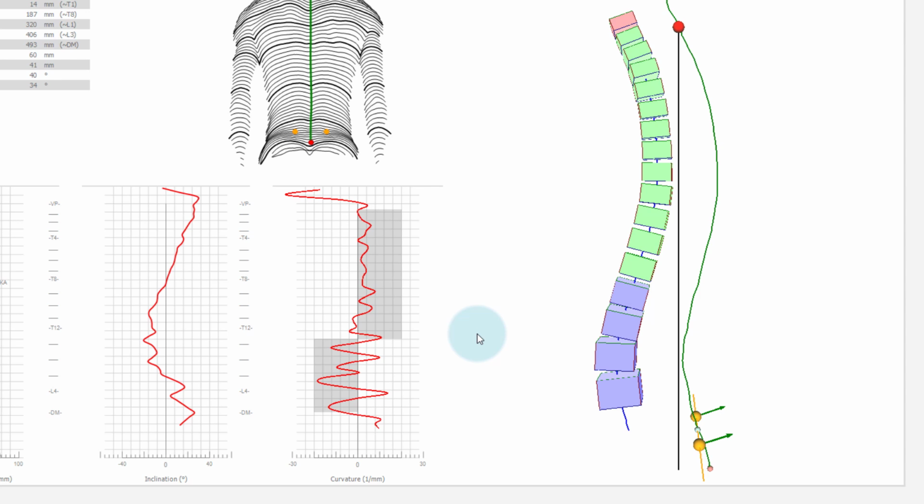If a segment stands far anteriorly, the elevation flattens. Likewise, it increases if there is a posterior shift. Local soft tissue retractions increase the deepening. The finger moves further anteriorly. Mathematically, we speak of a positive curvature in the thoracic kyphosis and a negative curvature in the lumbar lordosis. These target ranges are highlighted in gray on the graph. The height at which the gray area changes sides corresponds to the individual thoracolumbar junction. Here too, a lengthened kyphosis or a shortened lordosis could be quickly recognized.